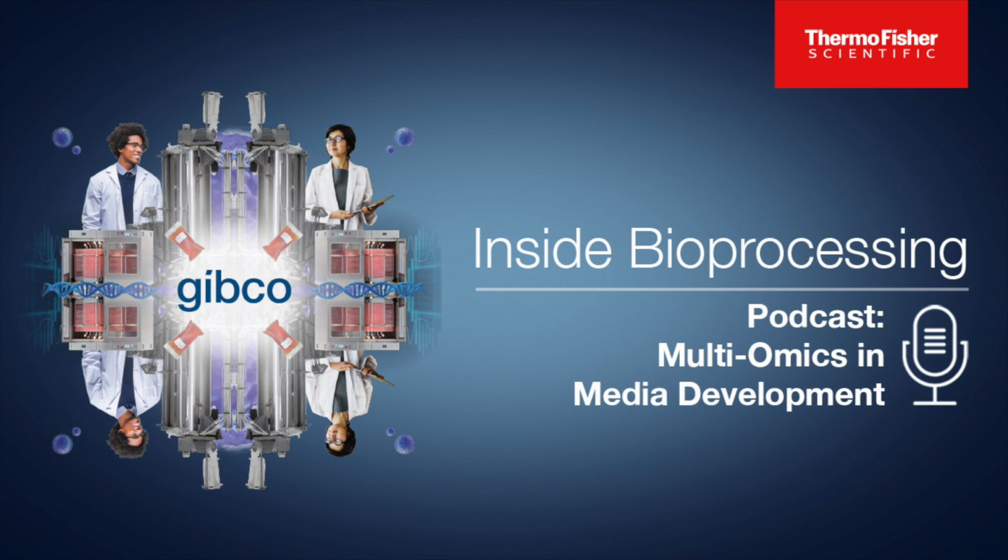And for proteomics, metabolomics, or lipidomics, scientists usually use gas chromatography mass spec or high performance liquid chromatography mass spec, like GC-MS or HPLC-MS, to study proteomics and metabolomics. And also, since we have different omics, right, we need to integrate them together. So we need lots of bioinformatics tools to perform data integration and data interpretation, and lead to our final DOE to optimize cell culture media.